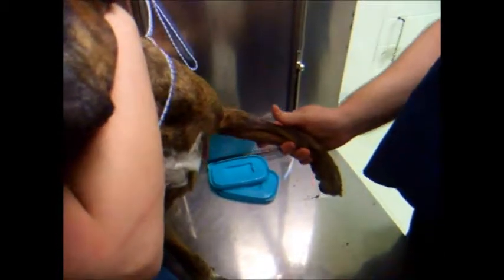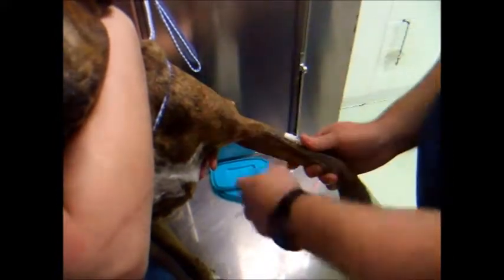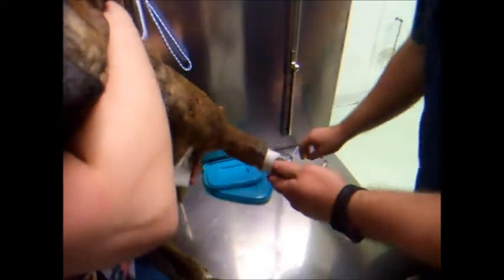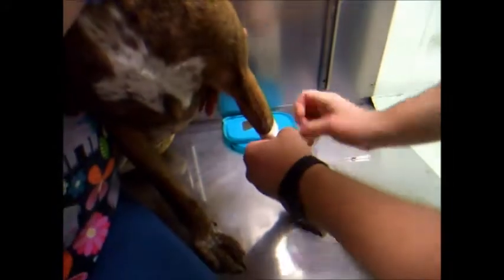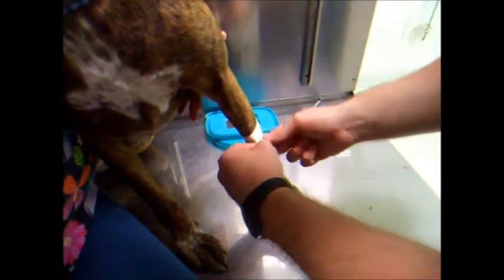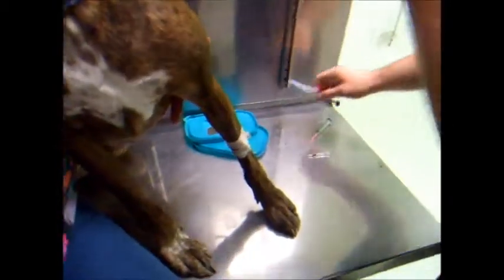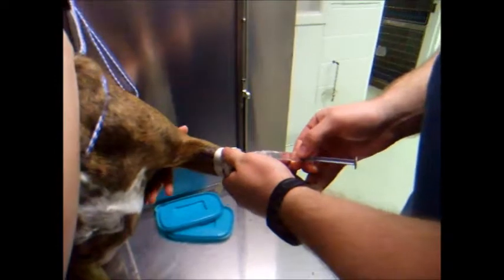We're going to go ahead and tape it. Make sure it's nice and secure. And now we're going to give it a good flush, make sure that it's in. Maria, if you could put your finger there just to make sure that it's in.